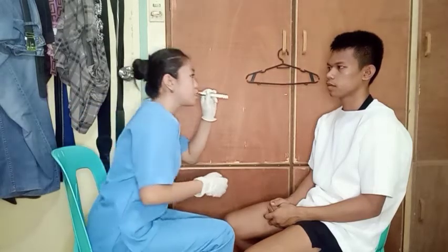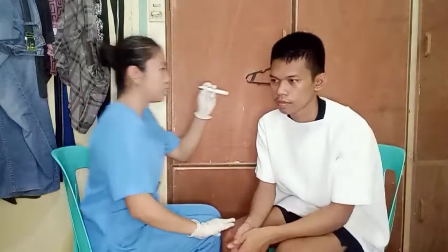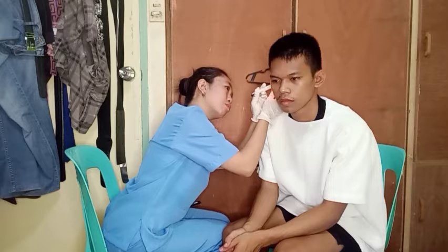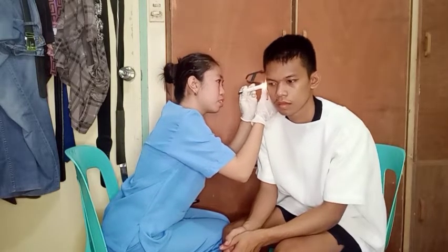So now next will be to inspect the tympanic membrane using the otoscope for the color, shape, consistency and landmarks. So sir, we will be moving on to the tympanic membrane for the same reason. I will be using again my pen light to check your tympanic membrane. Okay, a little bit closer, sir, please.